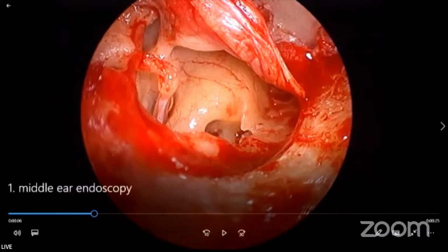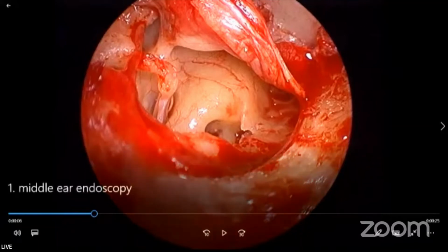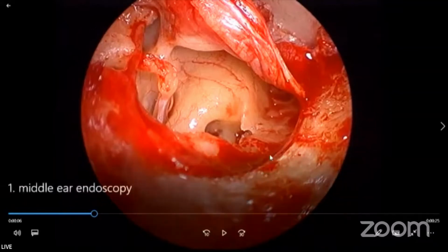Is it seen? Okay, perfect. So this is an M minus status. It's a very rare situation where you get isolated erosion of the malleus handle. So what is seen is, as just stated, anterior. You can see the fold over here. It's a medial flap, not a very big flap. It's a small flap which is elevated. This is the posterior rim of the cavity over here. So these are the various bony ridges that we have seen.